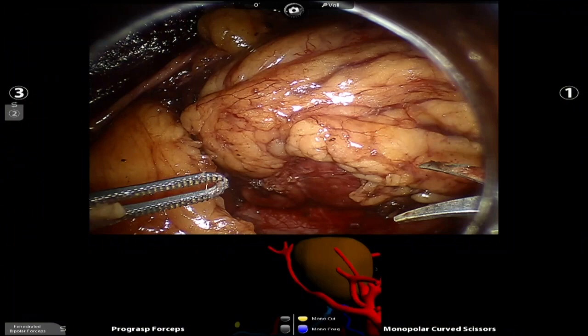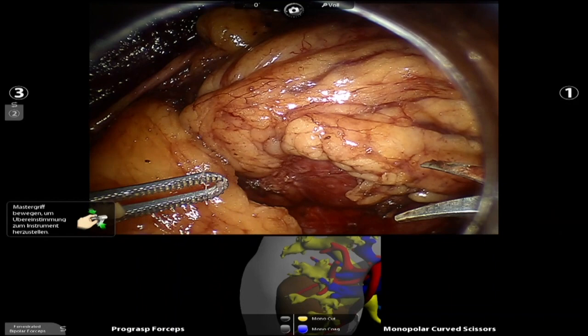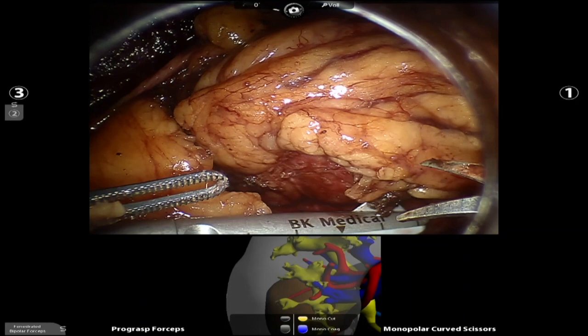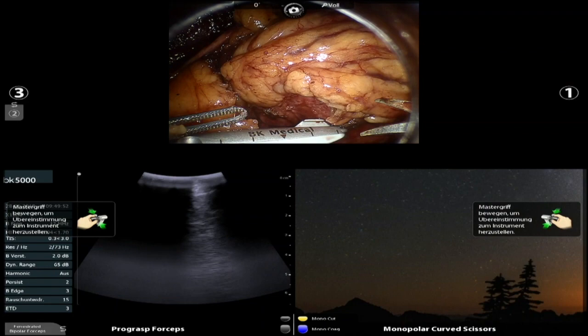Right now what I see, guys, is the 3D reconstruction, and I want to see the ultrasound. Can we see the ultrasound on the TilePro? Right now it's the 3D reconstruction. Okay, there it is. All right. I'm going to make this a little bigger. I want to see that ultrasound a little better. There we go.